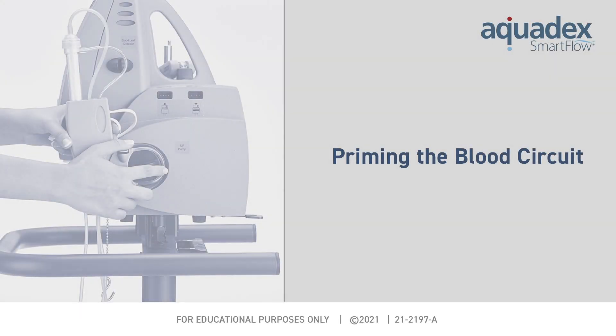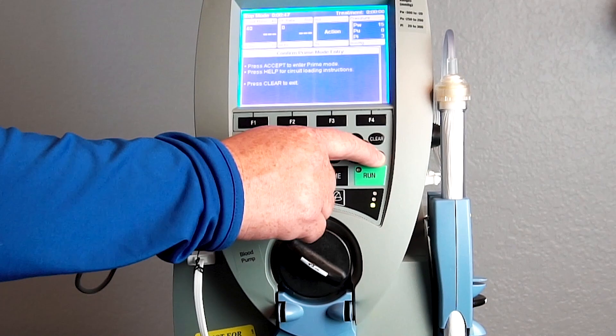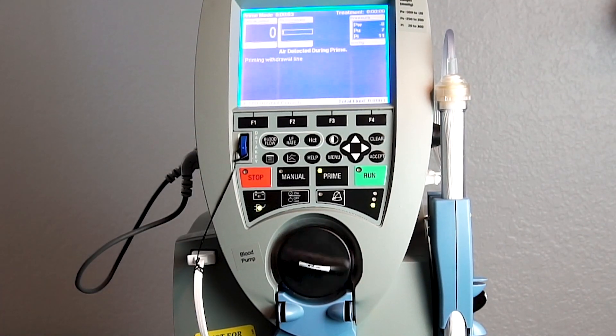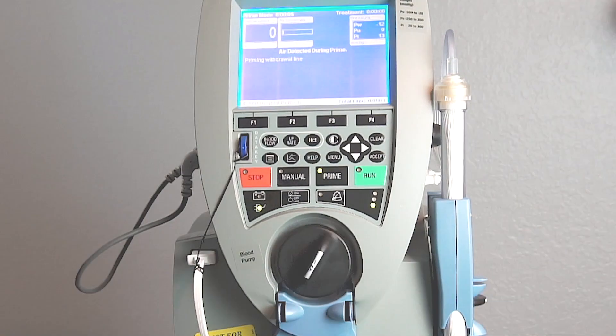Priming the blood circuit. From the prime menu, press the accept button to enter prime mode. The blood pump should start to rotate.